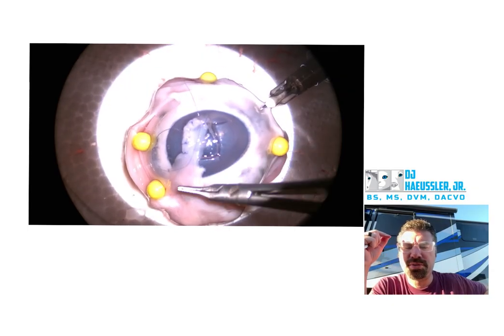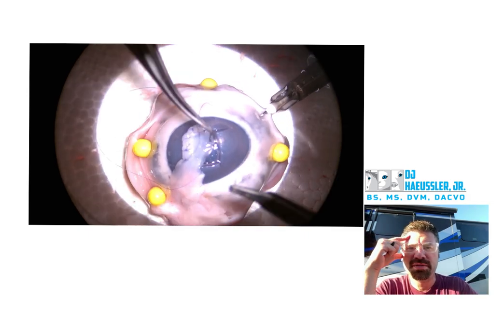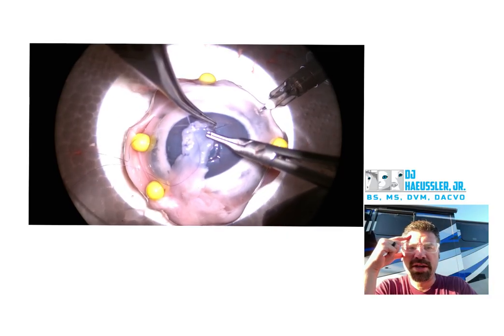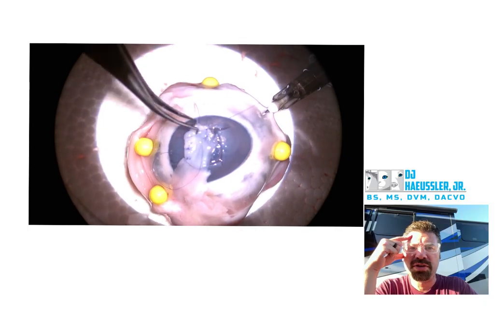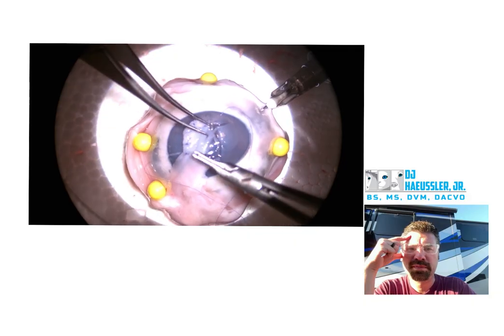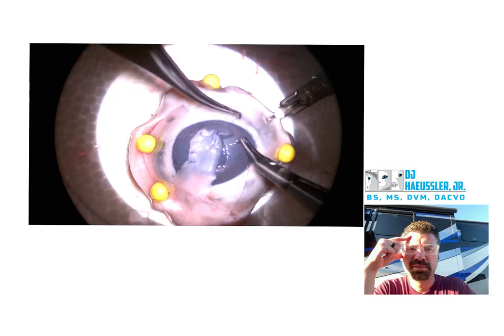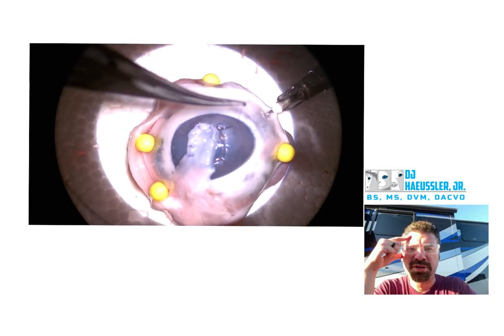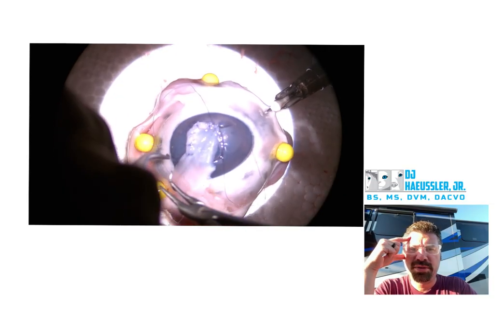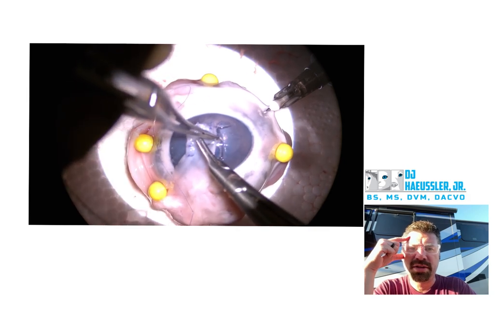Good job with your sutures — with your distance, as well as rolling your fingers, as well as holding the cornea on the opposite side when you're driving it through. Right there, that should have been your cardinal suture from the beginning — that's the exact placement of where your cardinal should have been from the get-go. Good suture management: not getting tangled up, being aware of where everything is, not twist-tying everything up or putting things in knots — good awareness there as you move through this.